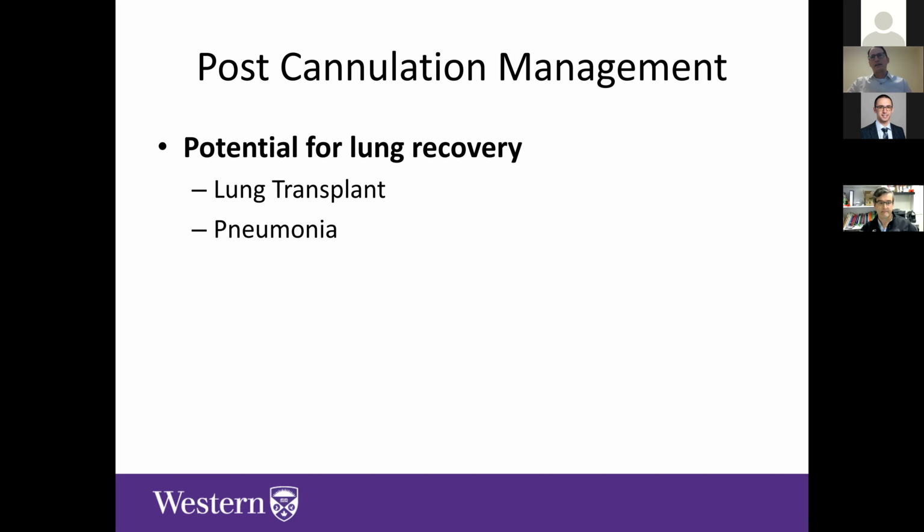And I think in the middle of those 2 extremes is probably where a lot of the challenge comes to manage these patients. Historically, that's been ARDS in the intensive care world, where you're not quite certain if and how quickly lungs will recover. And you're maybe sitting on ECMO for days or even a couple of weeks in extreme cases.